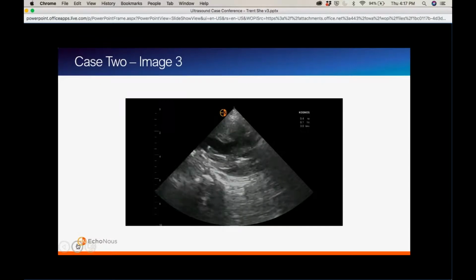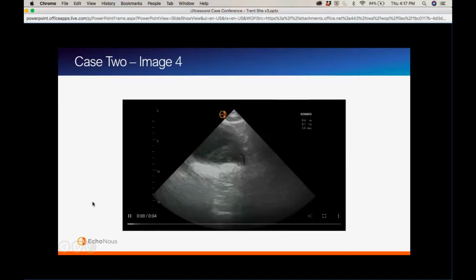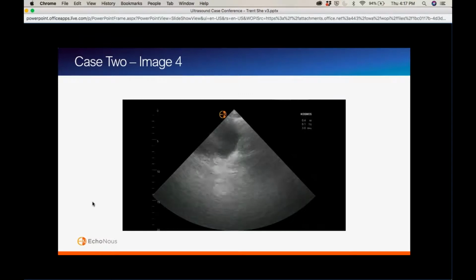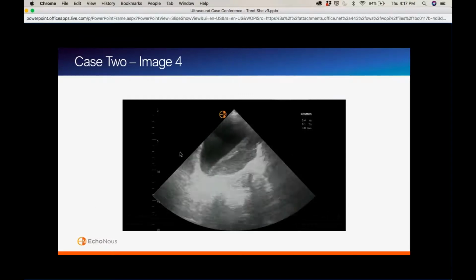Awesome. And so you could have stopped scanning there, right? And then potentially that would have been the end at the bedside. But you guys actually kept going on, which is quite interesting. And you found something that I don't think anyone was expecting. Yeah. So what is this?